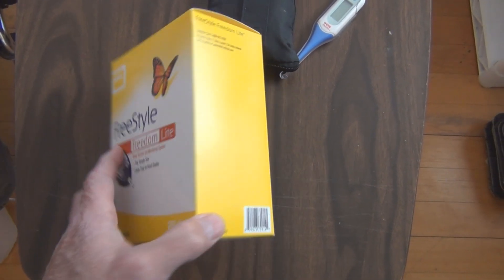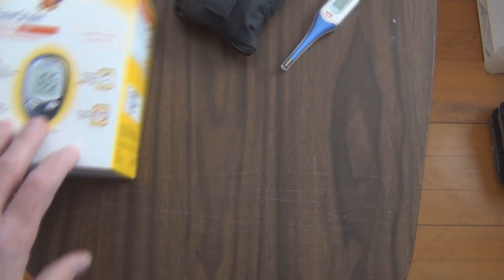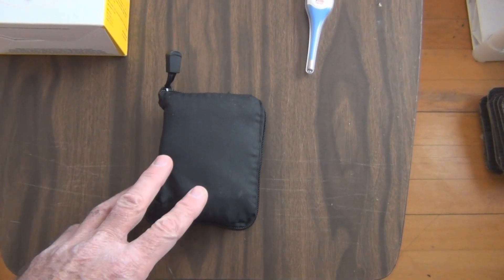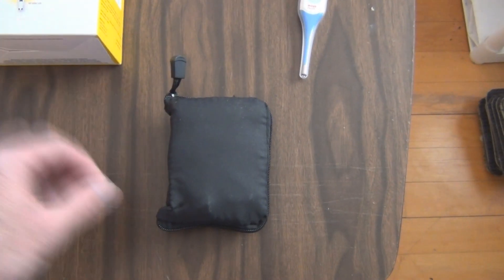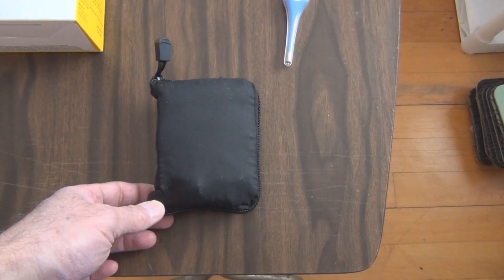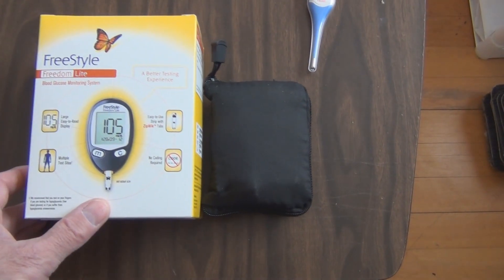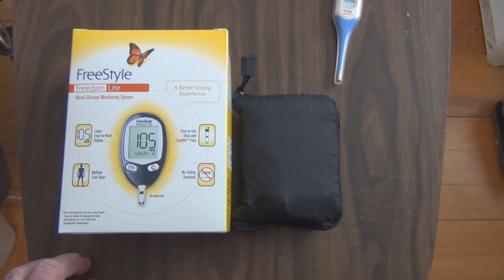I just purchased this and I'm hoping that it's the same as the old one. I like it because you can download the data onto the computer. There's some software that you can acquire from their website, download it and install it on your PC, and you can graph out all the readings that are stored in this meter.